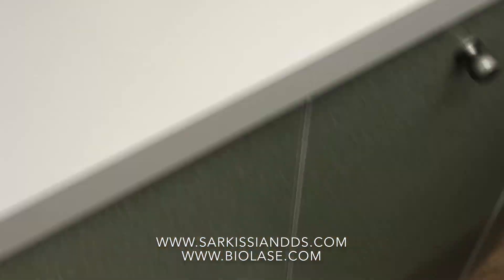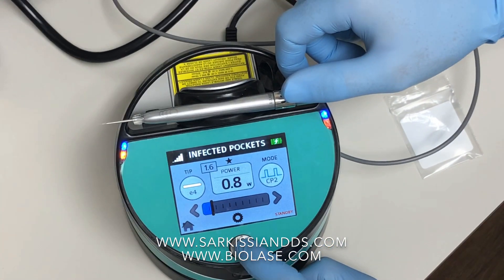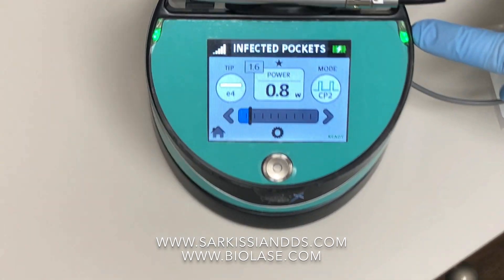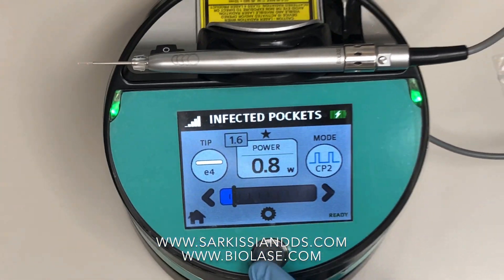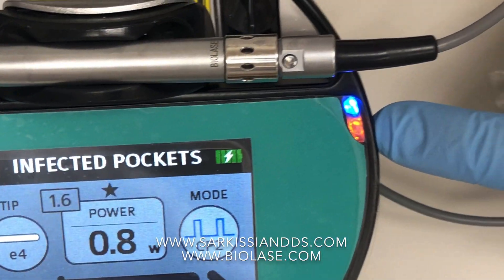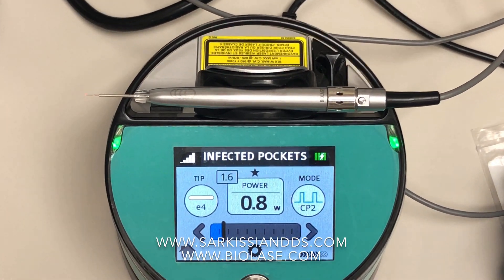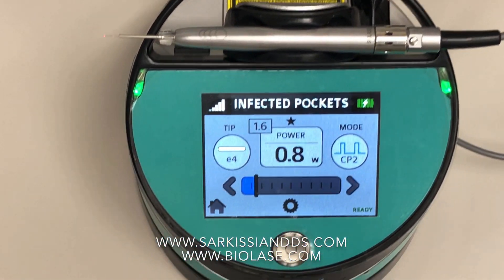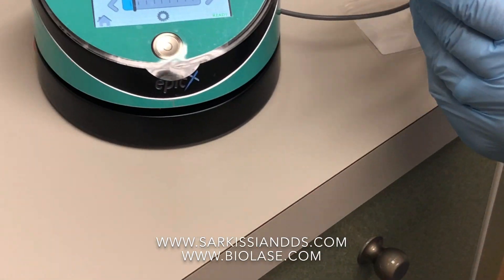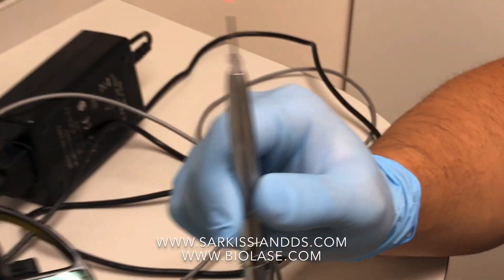Now we're ready to use the device. Press this key over here — it'll activate the unit. You know the unit is on when you see a green light over here, meaning it's ready to go. When it's off, you see an orange light; when you turn it on, it turns green. And when you look at the tip, you'll notice there is a red light at the end of the tip. It's ready to go.